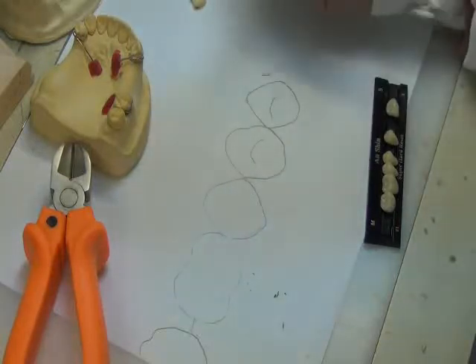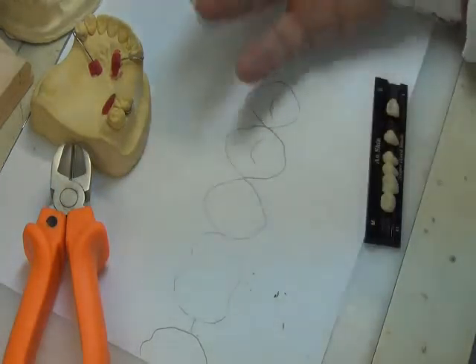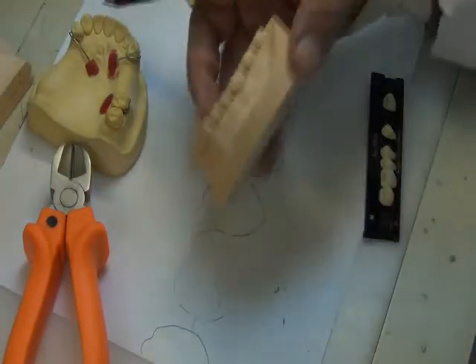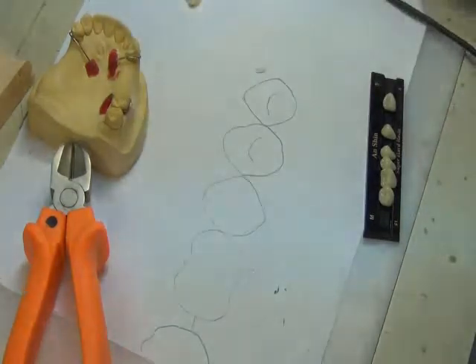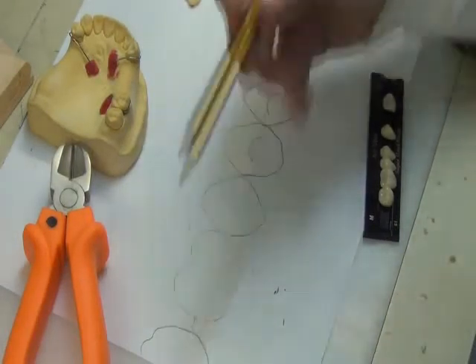This was natural spacing in the patient's mouth, for example. Otherwise, we're going to use teeth that are very much larger, and this will change the buccal shape of the teeth, because the buccal size of the teeth should also be similar to the natural tooth. So what do we have? We have a space here. So we don't leave the space between the artificial tooth and the natural tooth.